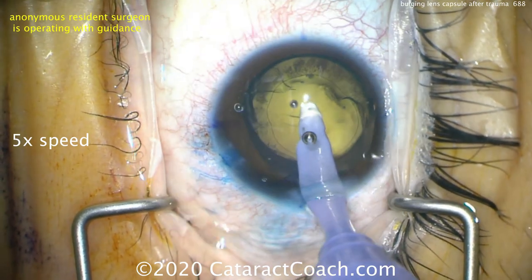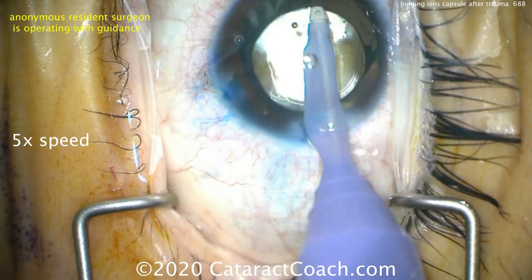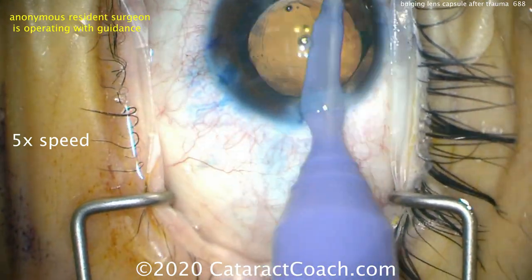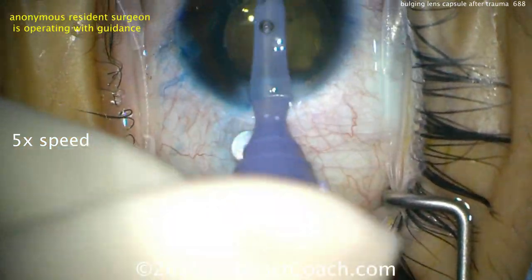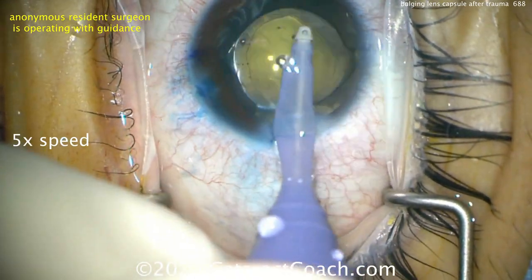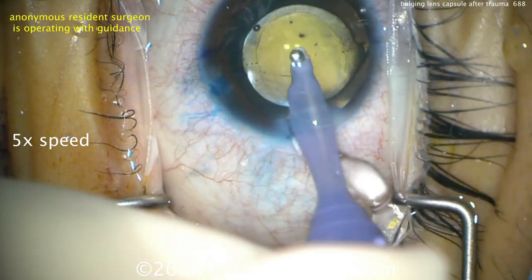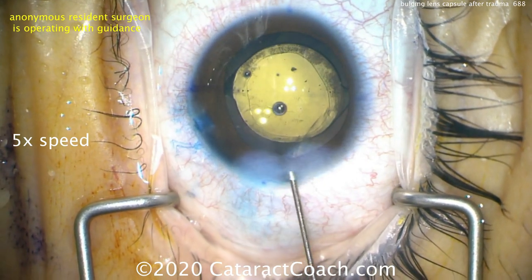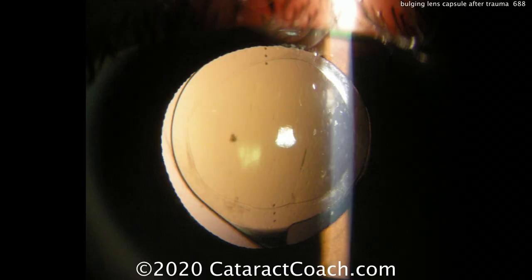You may want to spend a little more time here removing some of that lens material from the undersurface of the anterior capsular rim. Keep in mind, these young patients are far more likely to develop posterior capsule opacification, and nearly 100% of them are going to require a YAG laser capsulotomy in the first year or so after cataract surgery. There's the toric lens — the case goes beautifully, with a nice overlap of the capsulorhexis. The incisions are sealed, and at the slit lamp you can see we've restored the anatomy — the anterior chamber is deep and there's no bulging anymore.